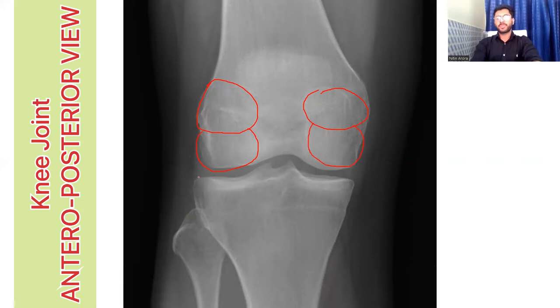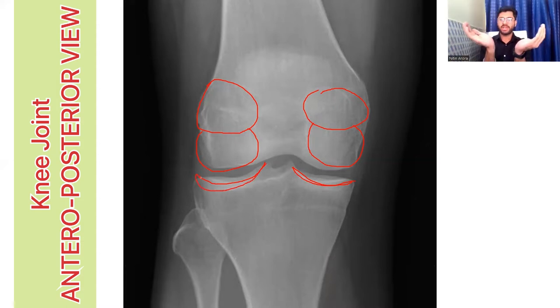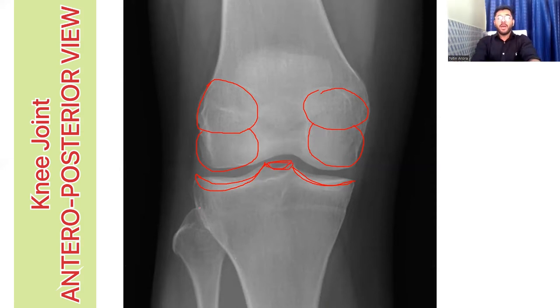This concave surface on the tibia is what you call the tibial plateaus. This one is the medial tibial plateau and this one is the lateral tibial plateau. These concave surfaces are the plateaus. The intermediary part between the two plateaus is what we call the intercondylar eminence. Here, the fibula that you see — this is the head of fibula and this part is the neck of fibula.